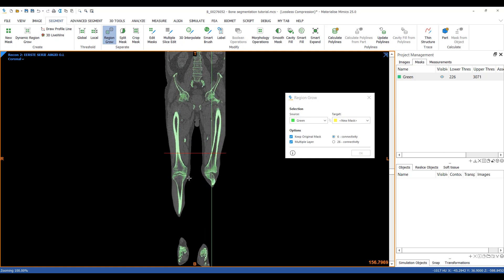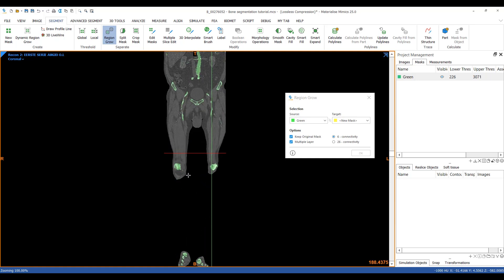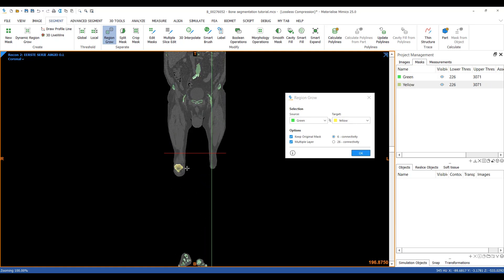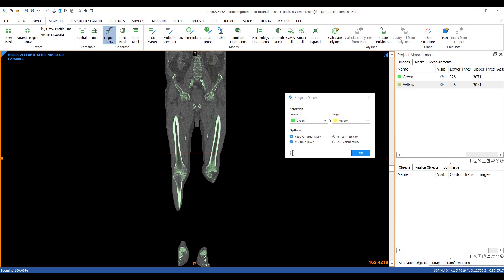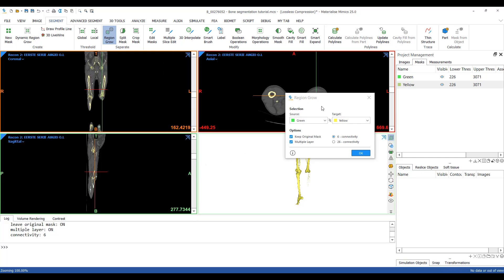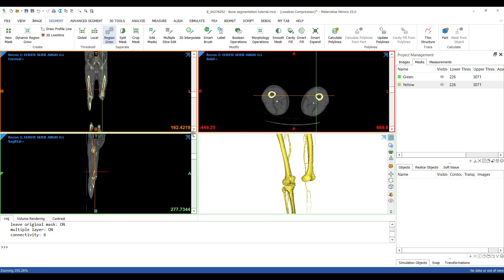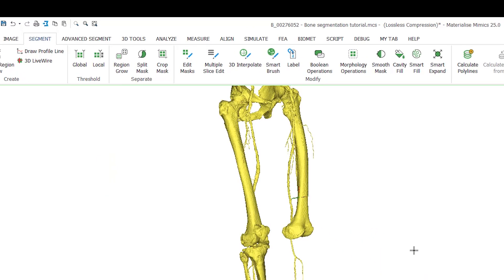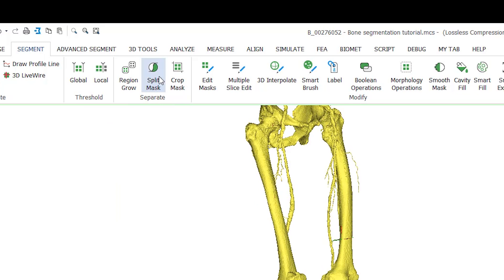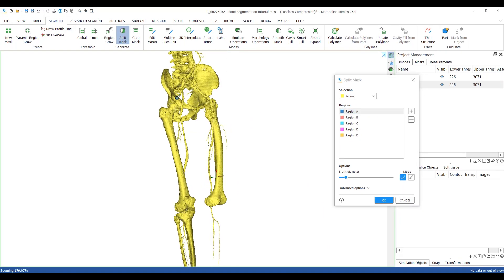These are the femur, patella, tibia and fibula. I can separate the bones from each other using the split mask tool so that we can work on them separately.